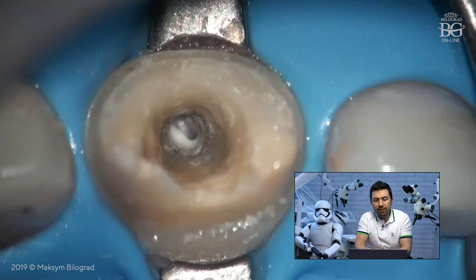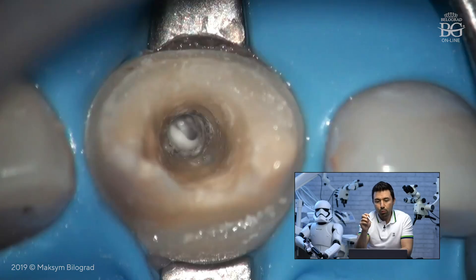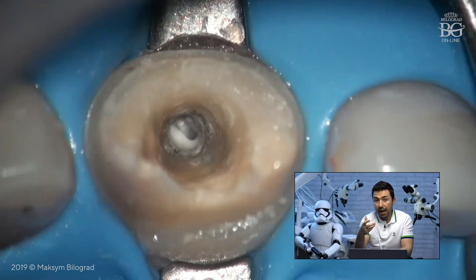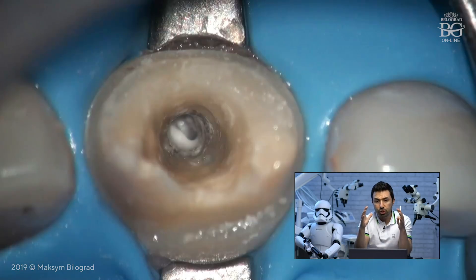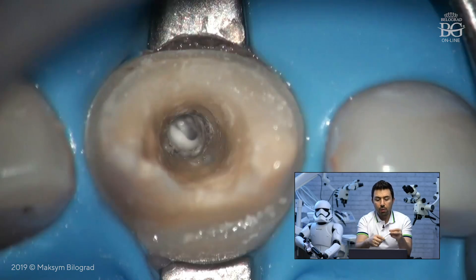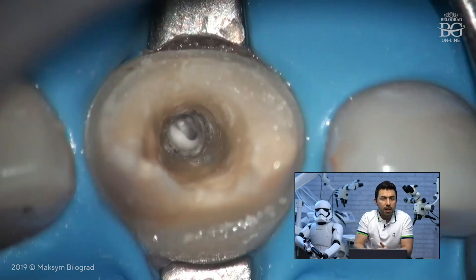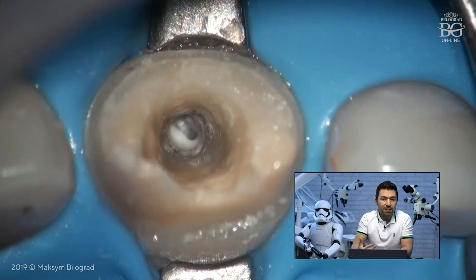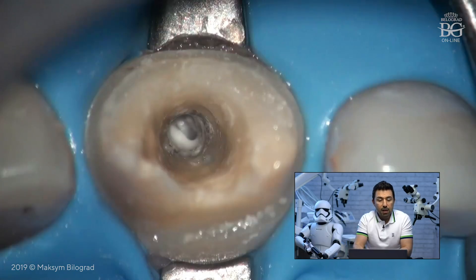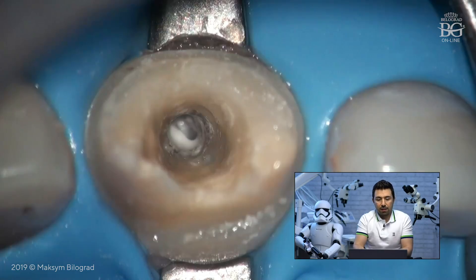Unfortunately in this case we were very limited with time. I am a big fan of calcium hydroxide dressing when we have intra-radicular resorptions and when we have to work with MTA. In this case we had to work with MTA because the apical size was more than 70. According to our experience, the best results of MTA setting were achieved after calcium hydroxide dressing. I am more into single-visit endodontic treatment, but when we have to go with MTA I prefer calcium hydroxide — because when you have inflammation, resorption, or apical periodontitis, you will always have an acidic pH, and MTA does not set well in an acidic pH.